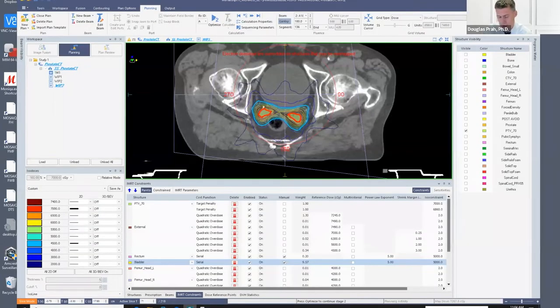In general, I run dosimetry at my center. I oversee all of the dosimetrists and just planning, commissioning. I personally work on maybe 2 to 3 cases a week, more challenging ones that the dosimetrists are struggling with. So to get started, if any of you have used Monaco, I assume that the group has as a whole, Monaco tends to be a little slower, since it's Monte Carlo.